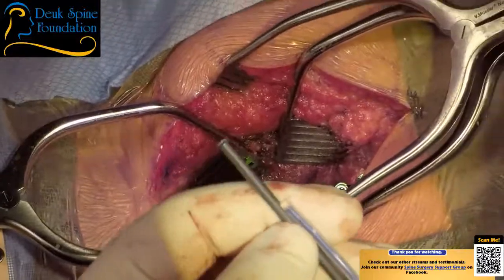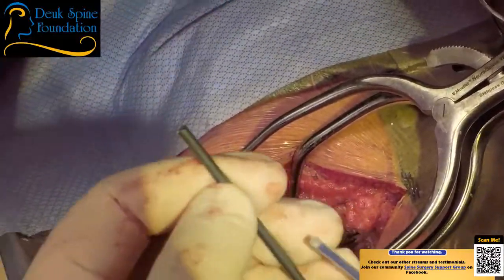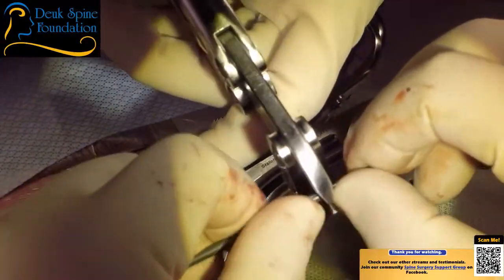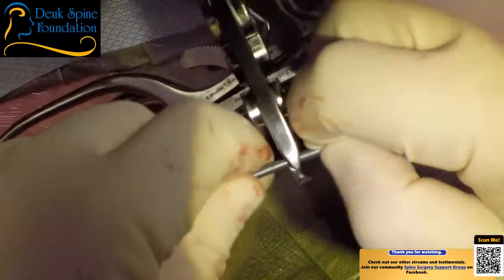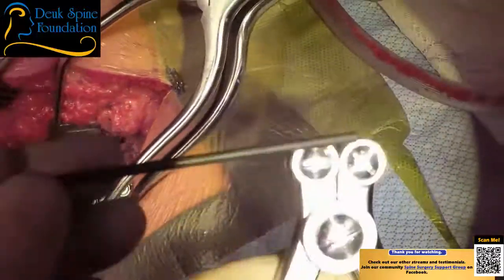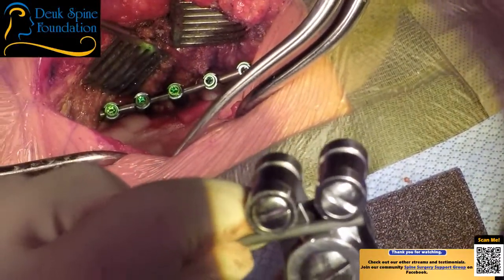Actually, we have to cut first. Let's go ahead and cut, just a little bit. We'll probably have to recut. But the answer is yes, you'll be able to drive a truck, any kind of truck you want. You could even load and unload a truck. But you've got to give your spine time to heal.